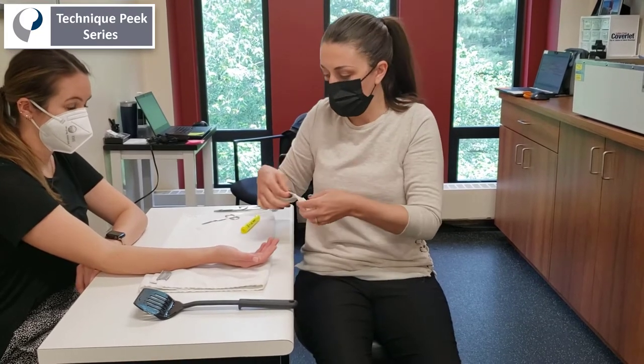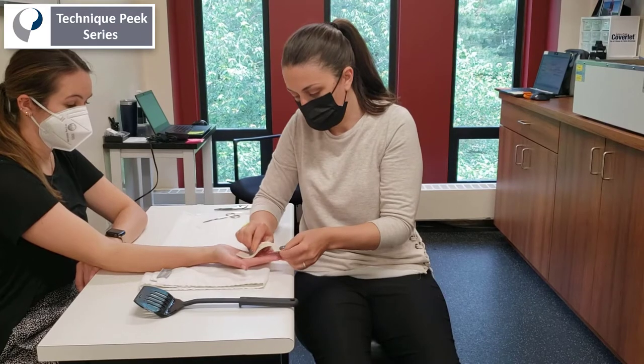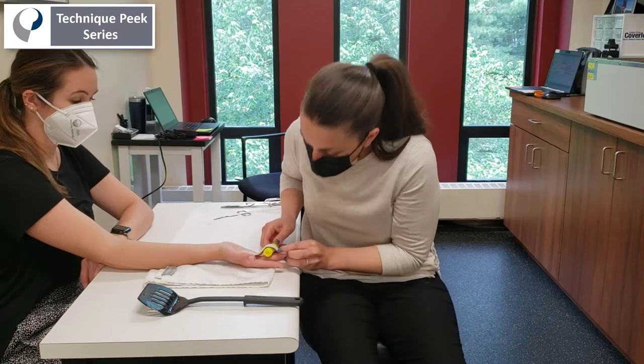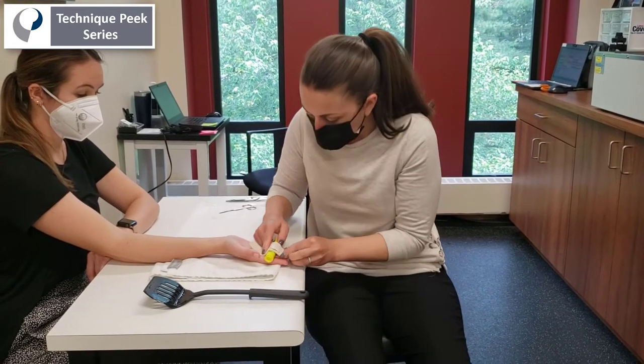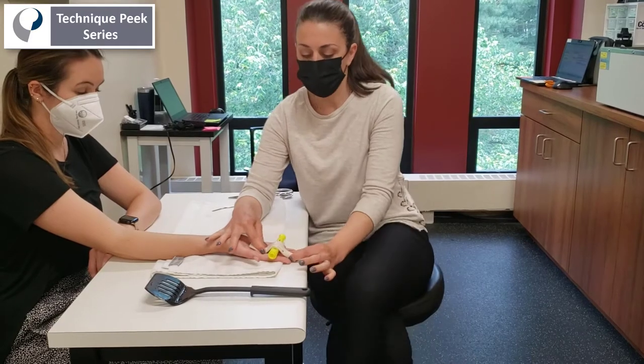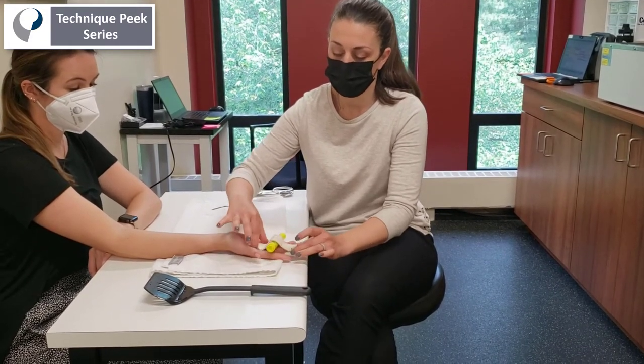Then I'm going to mold the material over the length of the involved finger, starting just proximal to the MP joint all the way to the tip of the finger. I like to use a little marker to place over the PIP joint so that we can get nice conformity without having to worry about maintaining that flexion there.